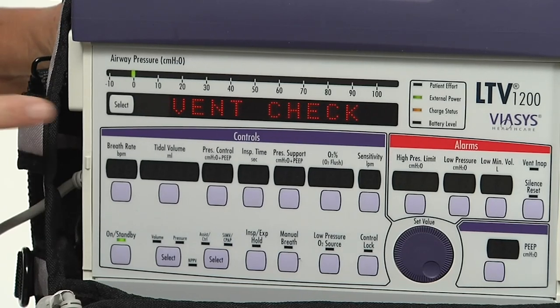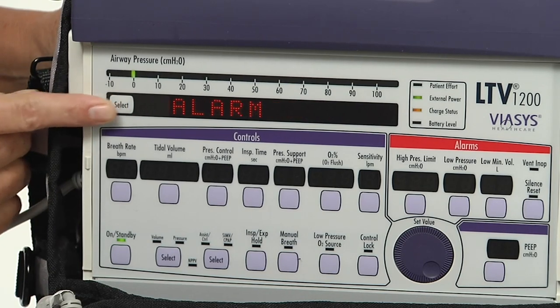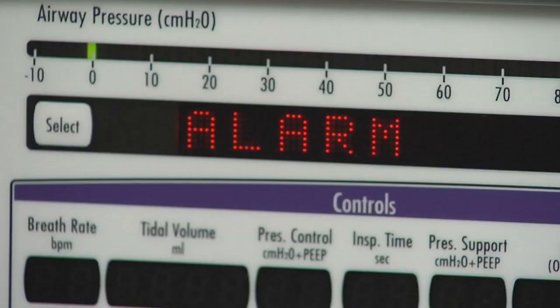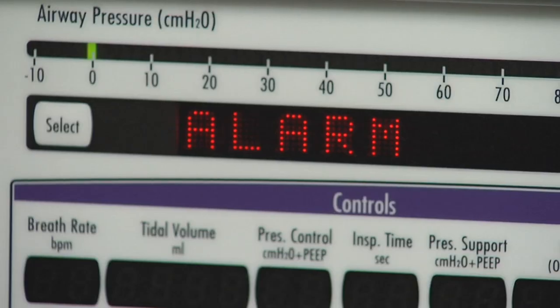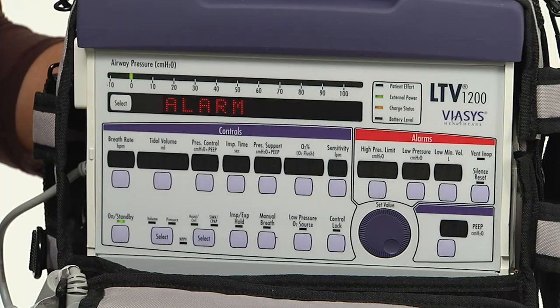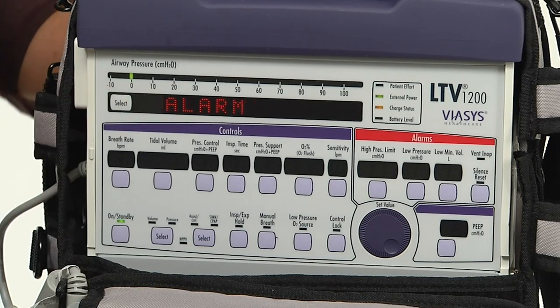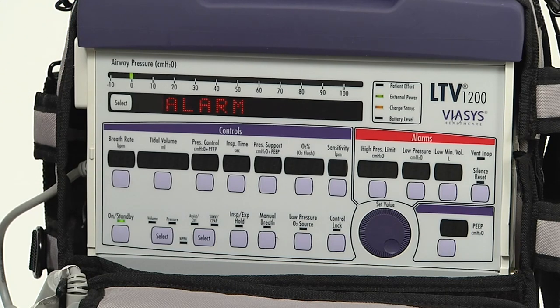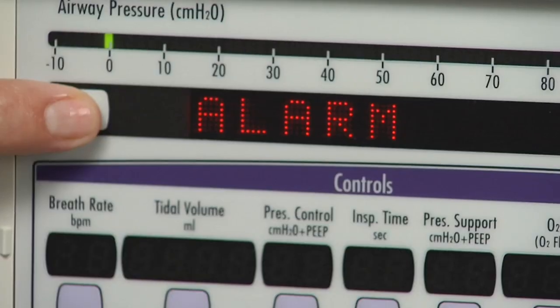Press the select button. The first ventilator checkout test — alarm — is now displayed. Use the alarm test to verify that the audible alarm is working correctly. To run the alarm test, push the select button while 'alarm' is displayed. Verify that the audible alarm sounds.